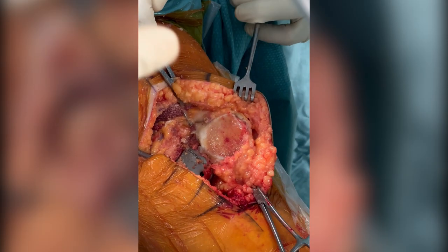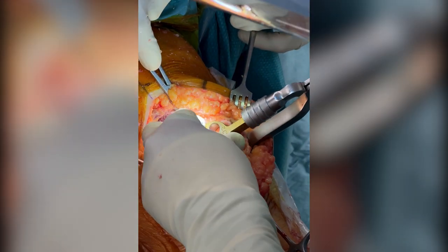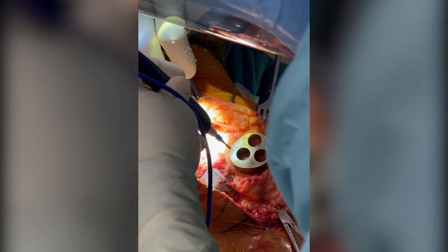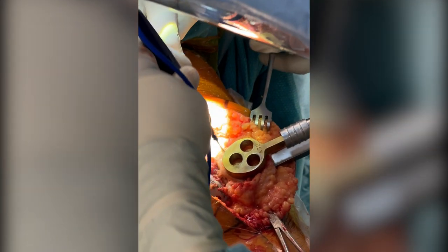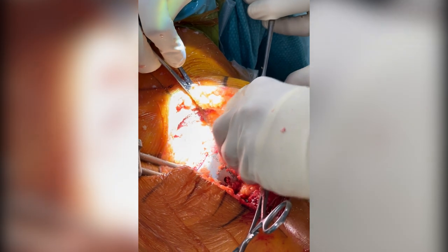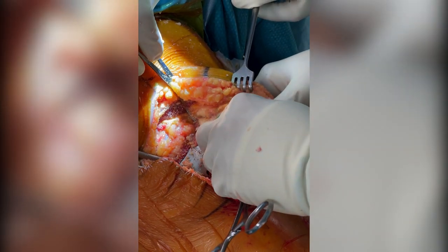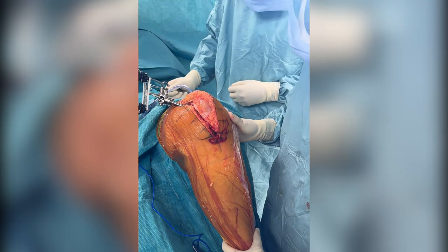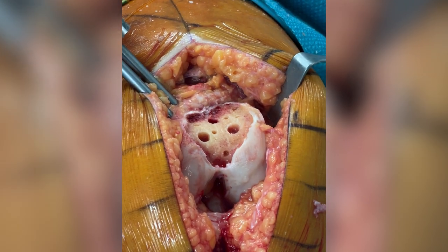We want to restore exactly the pre-arthritic state with the pre-arthritic geometry of the articulating surface at the right thickness. Preparing the fixation lugs for the patellar component — this needs to be very exact, this is for size 32. Insertion of the fixation clamp for the patella, and once we are perfectly satisfied with the position, we can drill the lug holes. Inserting the trial patellar component, and doing our first check on the gliding and the stability of the patella, testing in full flexion going to extension.